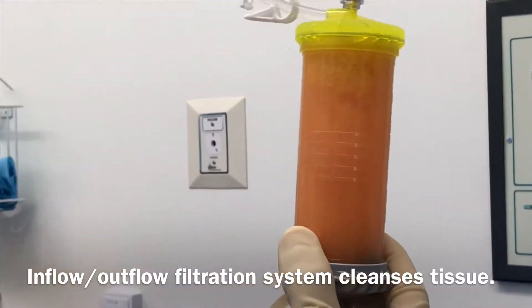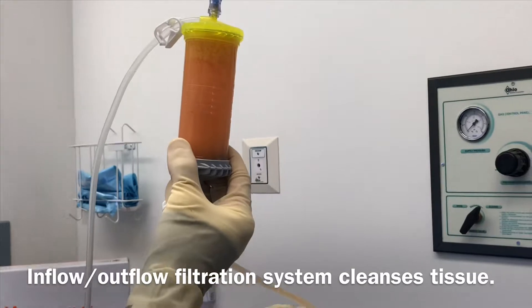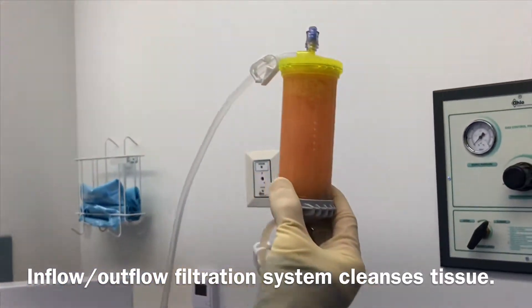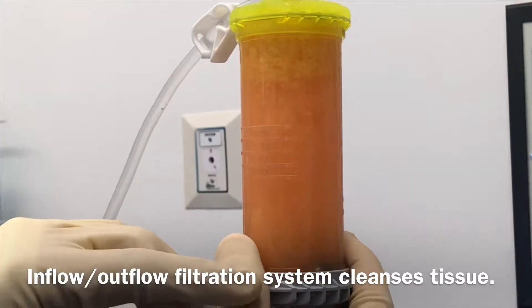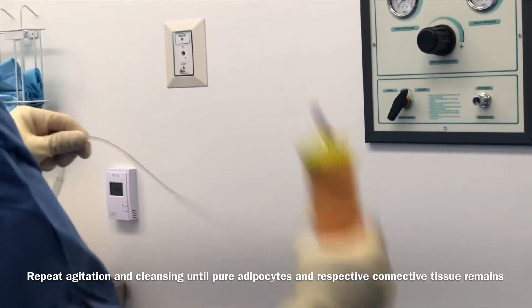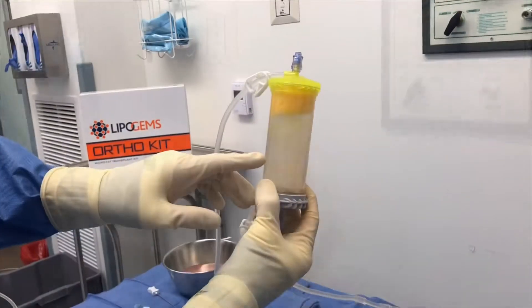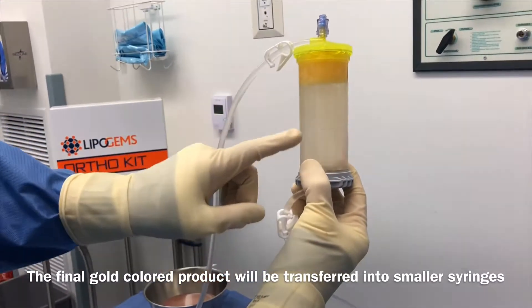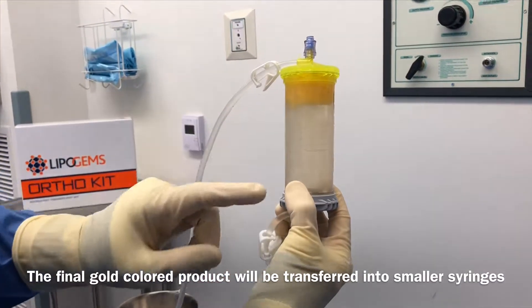We're now flowing in with saline and flowing out with impurities, with oils — things that we don't need. What we'll be leaving here is the micro-fragmented fat. You can see how it's becoming clear; we're getting purified micro-fragmented tissue right there.